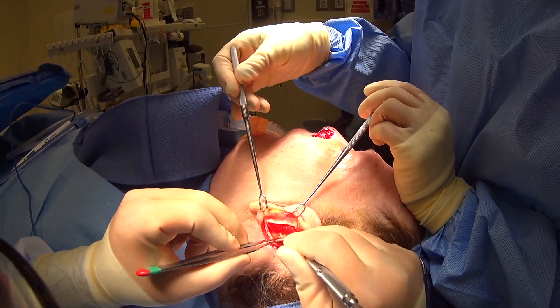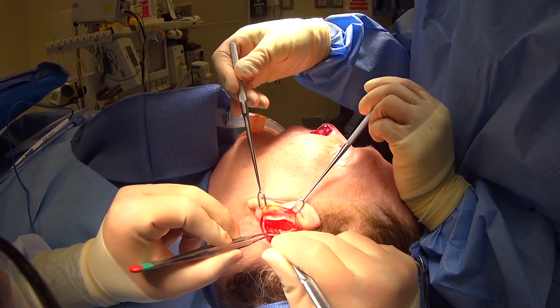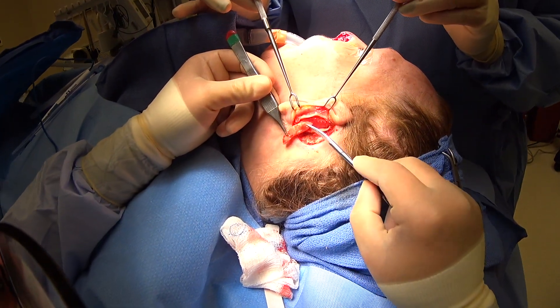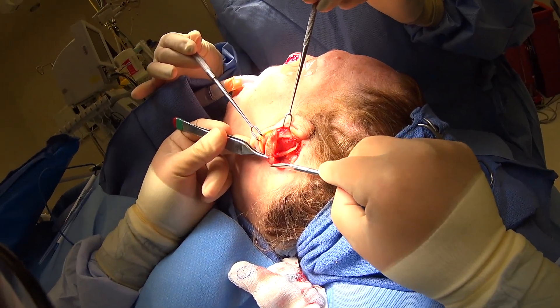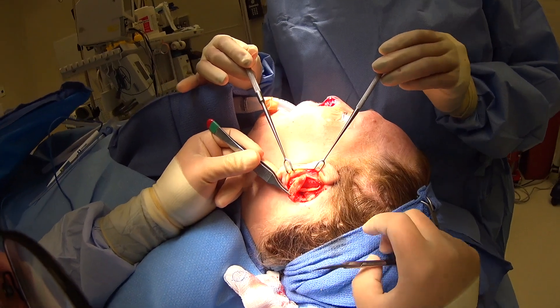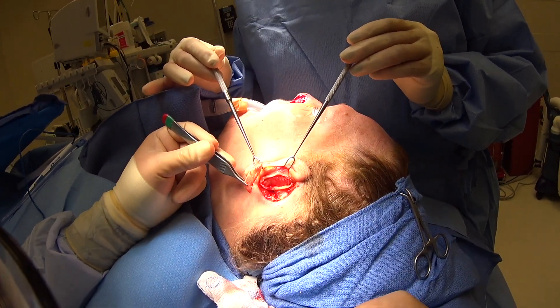We'll free up plenty here and close it all up. You can see we've taken out our cartilage — you can see how this is going to make a great alar rim and really support the nose. We'll put this on the back table, get the ear closed, and then come back to the nose.